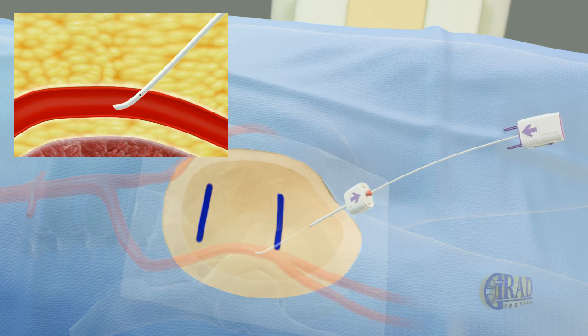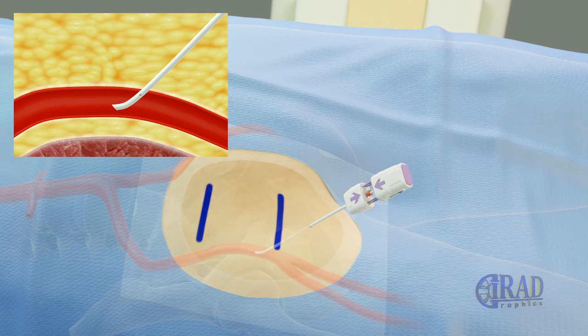The collagen plug carrying component is assembled and advanced into the sheath. After attaching and clicking the last part, the whole sheath is pulled out until resistance is felt.